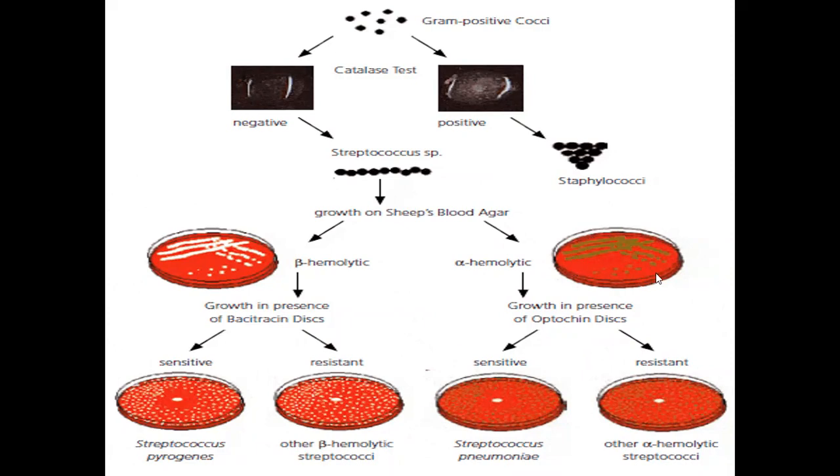In the case of alpha hemolysis, you should think about Streptococcus pneumoniae and other non-pathogenic alpha hemolytic streptococci. To differentiate, you should use an optochin disc and a disc with bile. A positive reaction means that this is Streptococcus pneumoniae. Negative means that it's another, non-pathogenic one.